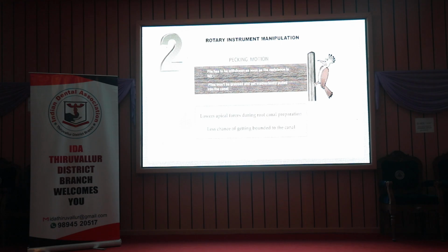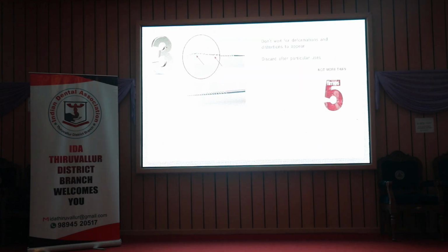Then pre-enlarge the root canal with your hand instrument before you use the first rotary, so that the chances of the file getting bound inside the canal is lesser. Now you can understand the reason for the in and out and constant motion of the file. They even say not more than 5 seconds of the file at one position. So that prevents the taper lock, sorry, the torsional fatigue.